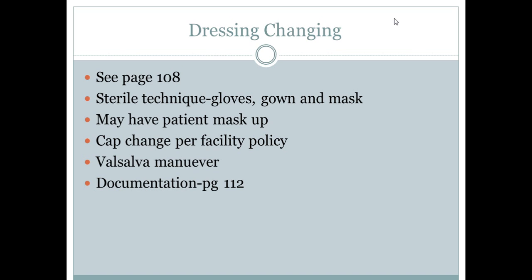We'll talk about that, and we'll be doing that in our skills lab. But while you're doing that cap change, you would have the patient do the Valsalva maneuver again, to bear down, just put extra pressure on that to reduce the risk of air emboli.